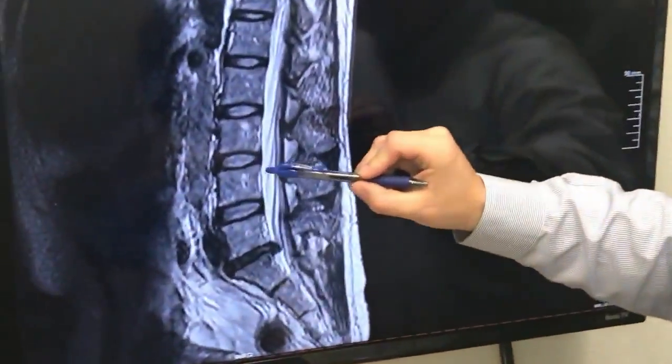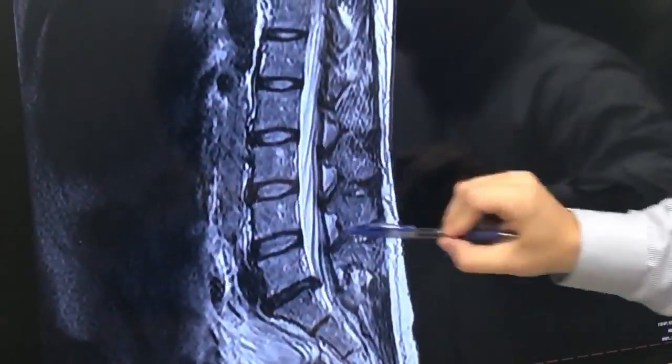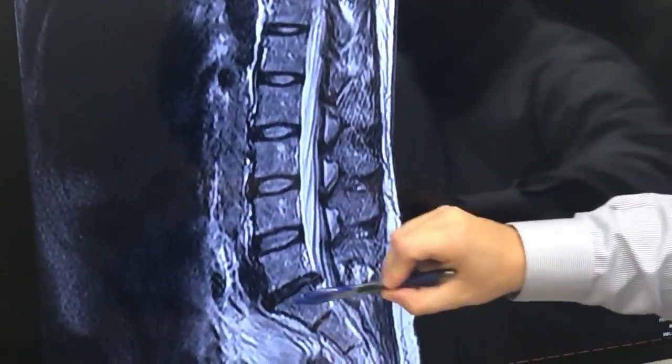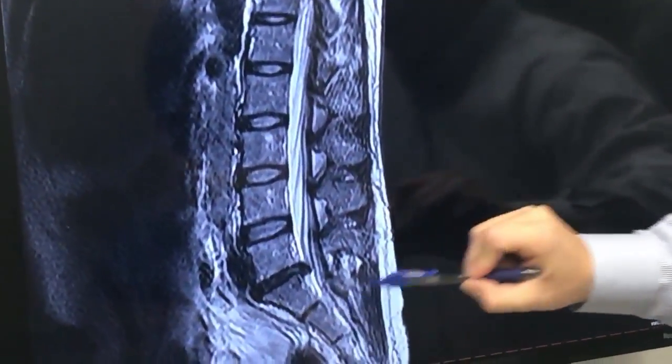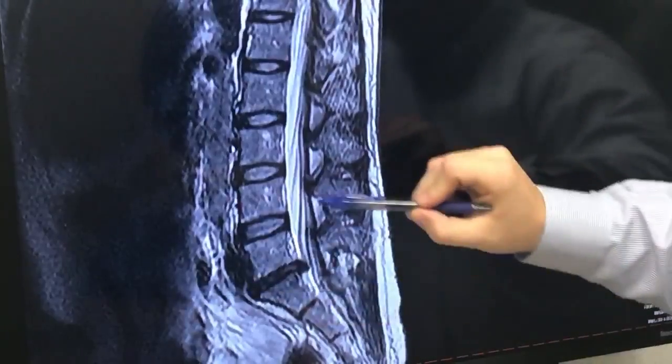Over here is an MRI. This is someone's belly, this is their back, this is their tailbone, and this is their waistline.